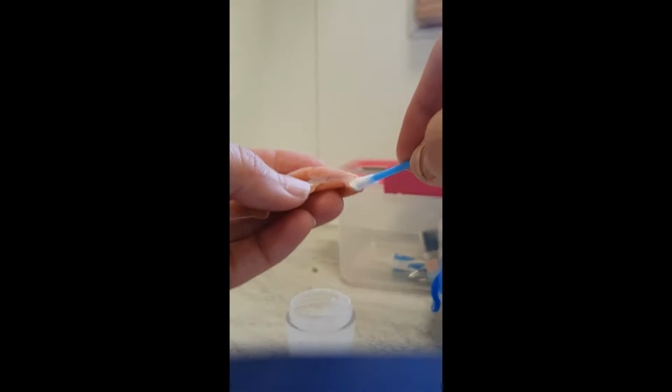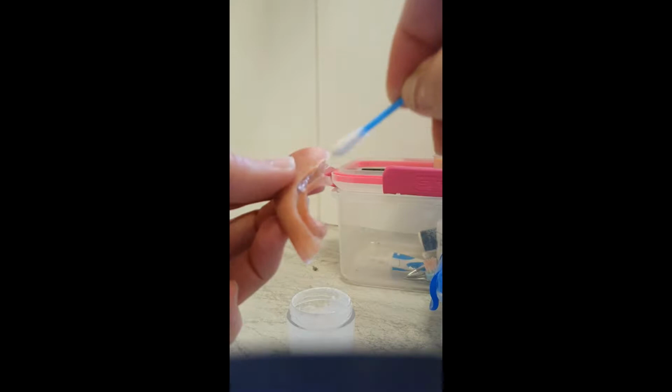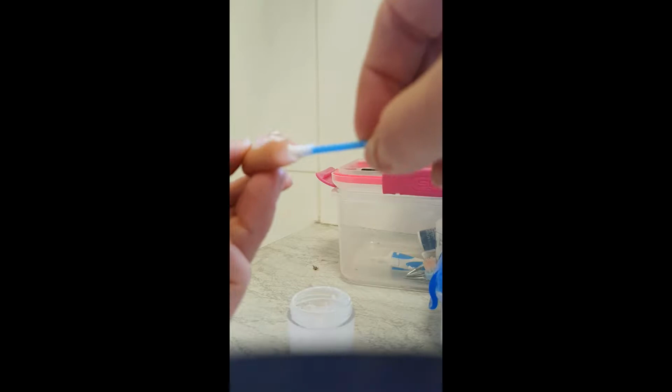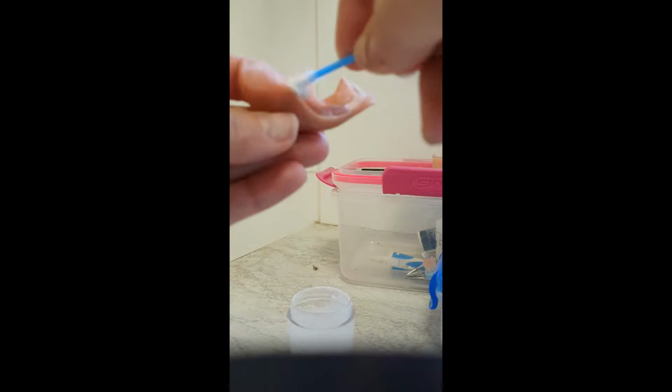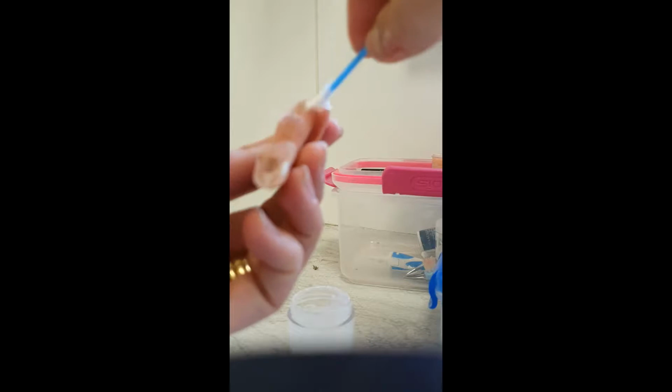Rub the glue all over, especially on these tiny little parts, because they're the ones that later are going to battle to stick down, trust me. And this one is the other guilty part. There is some little fluff there. And then we carefully go all over the inside and put some glue on. Excellent. Now you can see this is quite white.